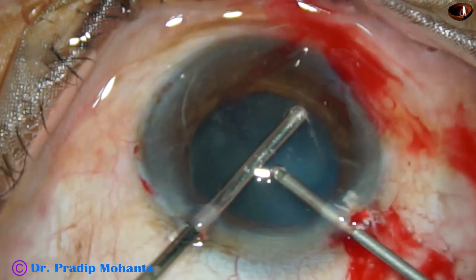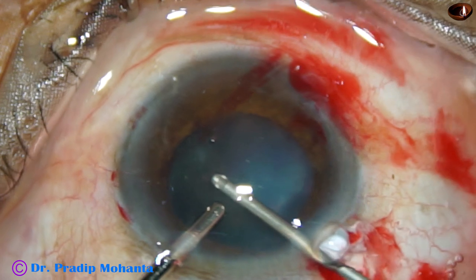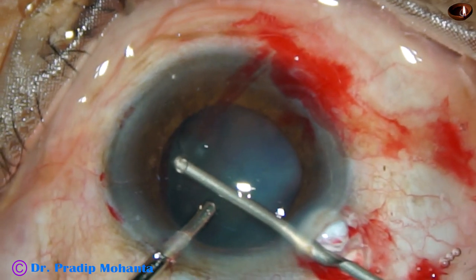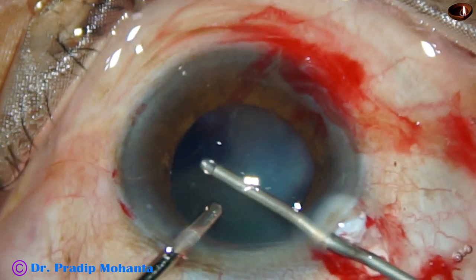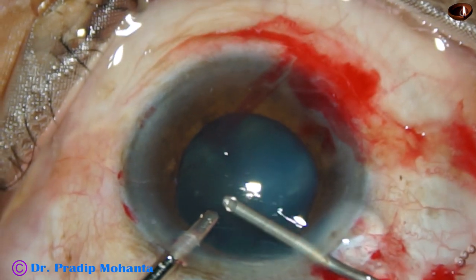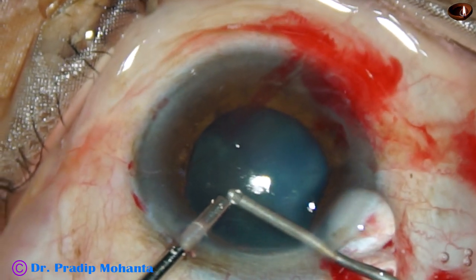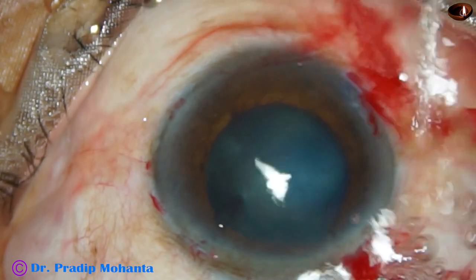This is a 23-gauge cutter from Oatley, Switzerland. Some vitreous is coming out through the main incision, so we have to take care of that also. The vitrectomy part is not edited in this video, because this is the main part the viewer should concentrate at.